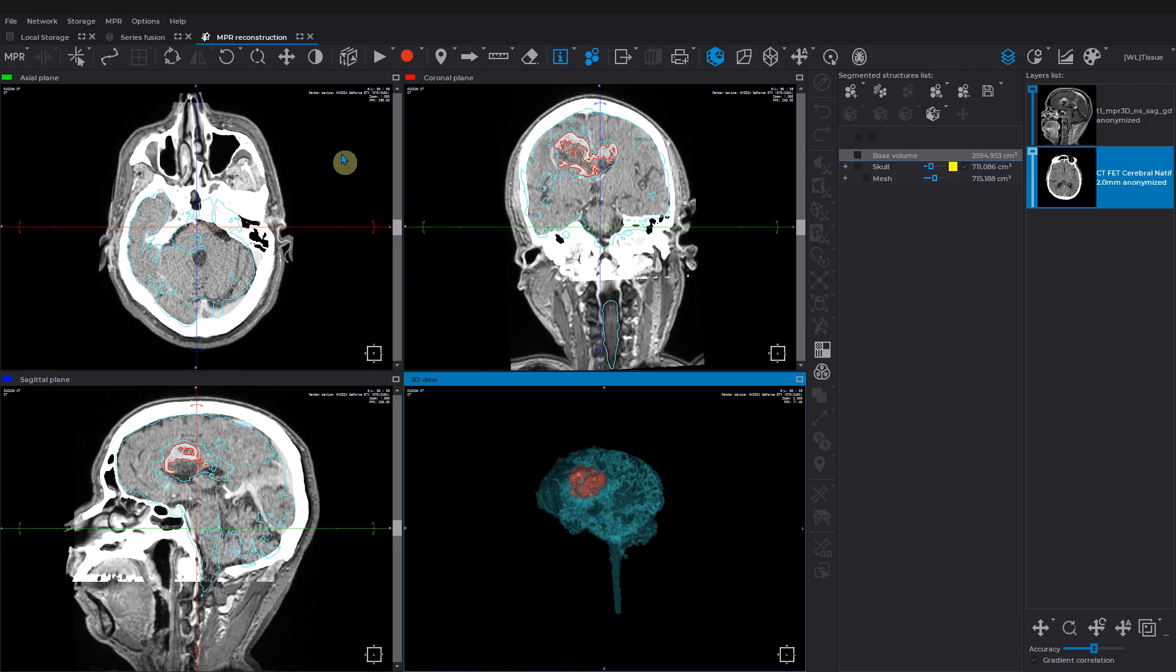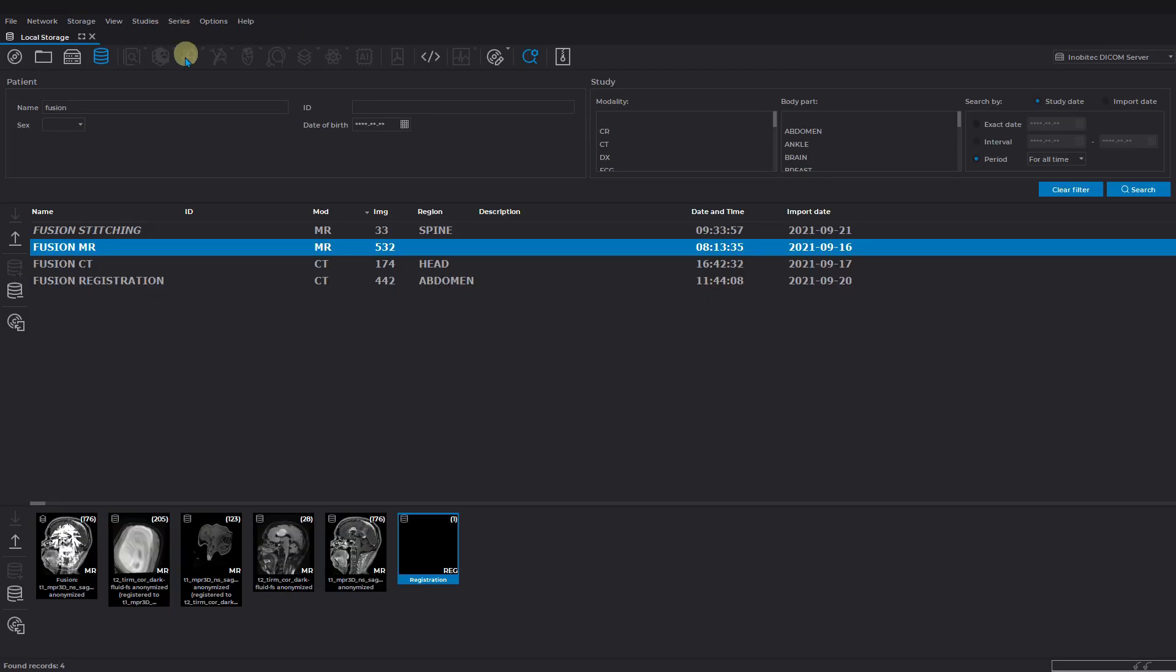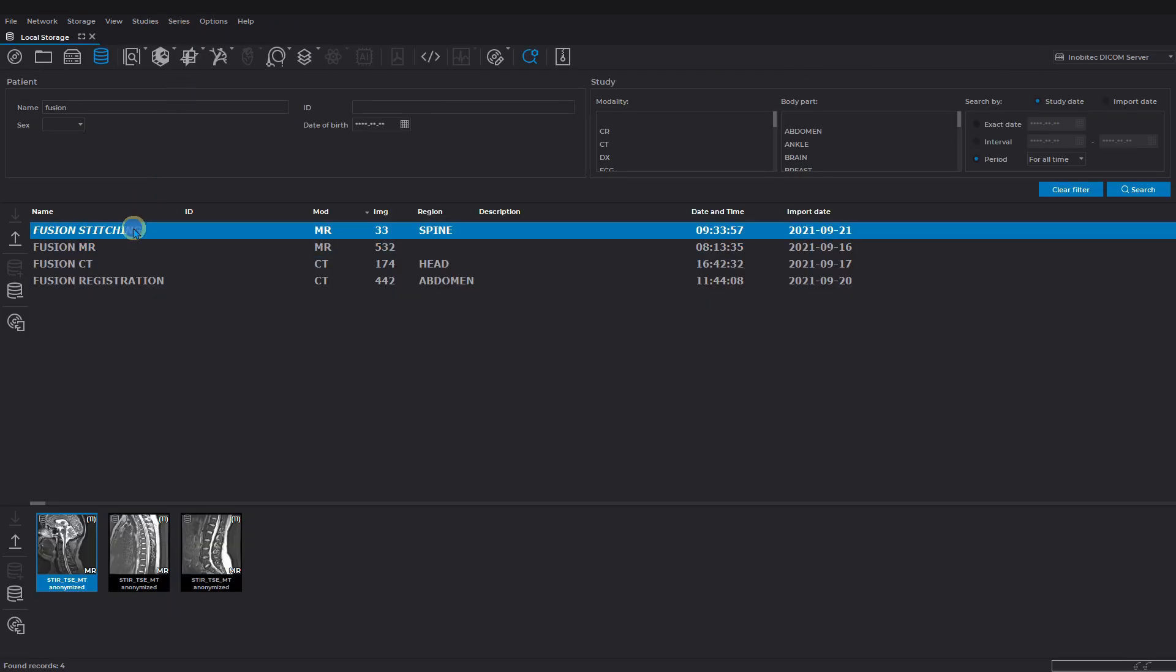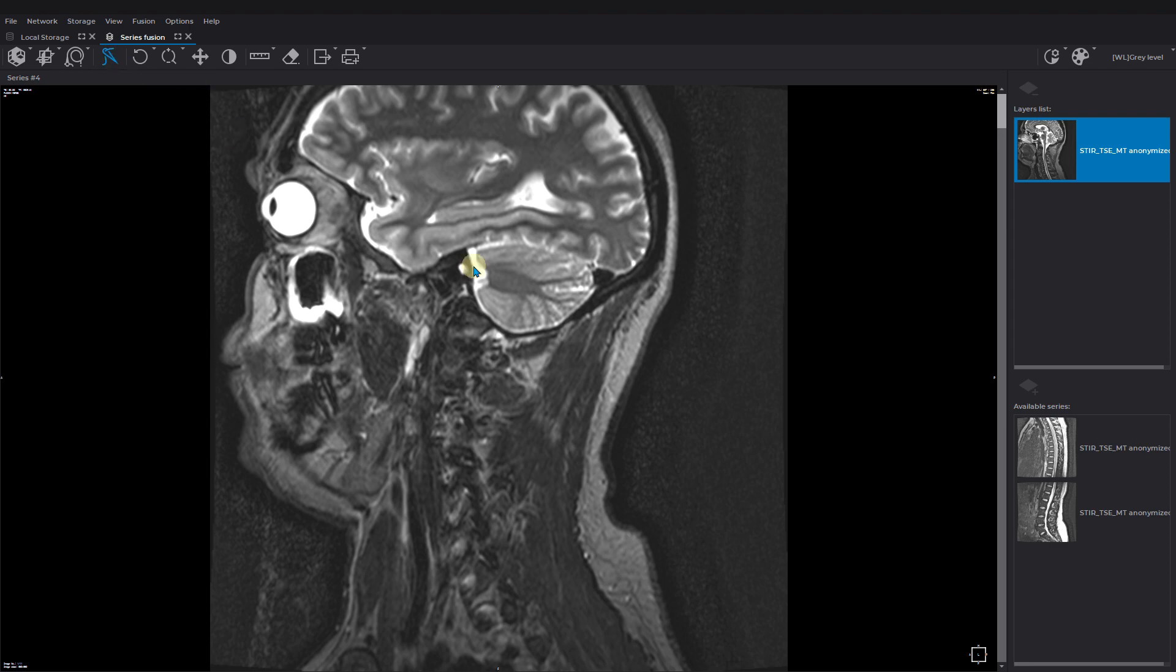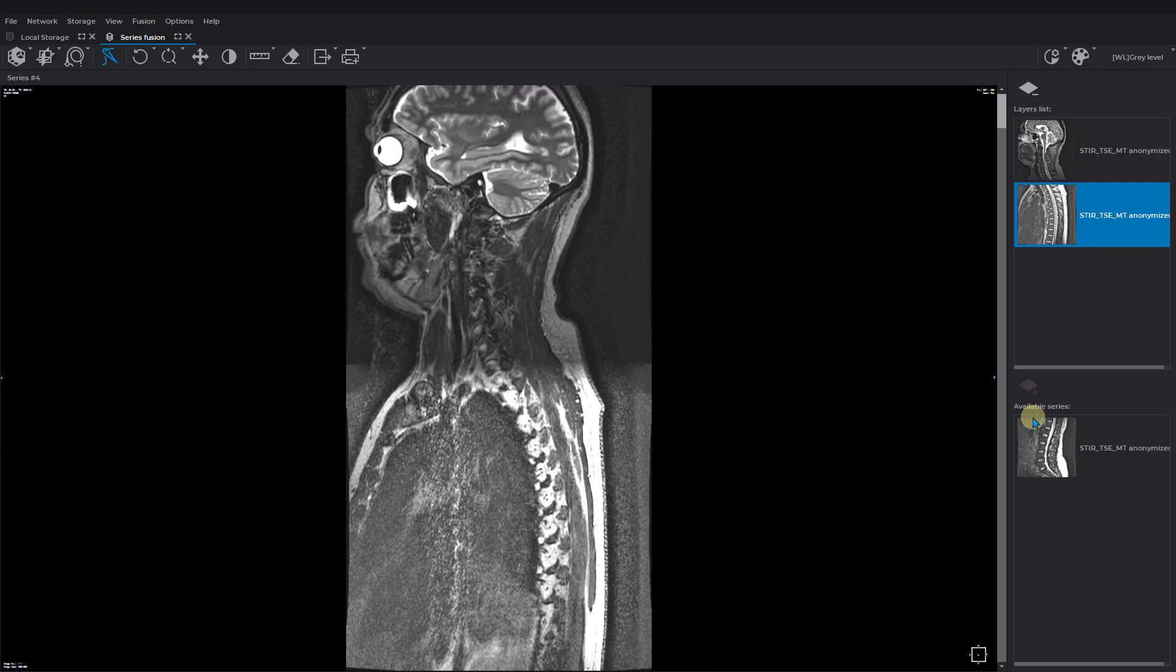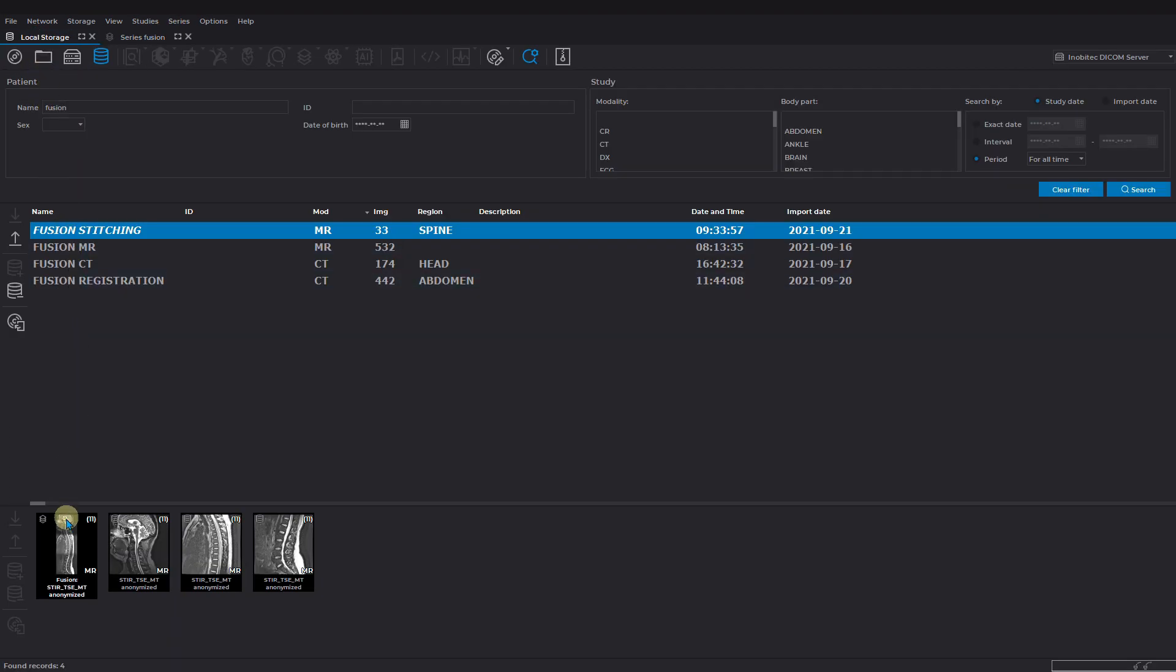Let's move to the next tool, stitching. Choose a series and activate the series fusion tool. Activate the stitching tool and add the respective series afterwards. As a result we have the stitched series, which can be opened as regular series, for example, on 2D view mode.